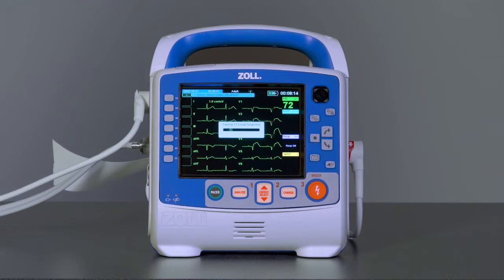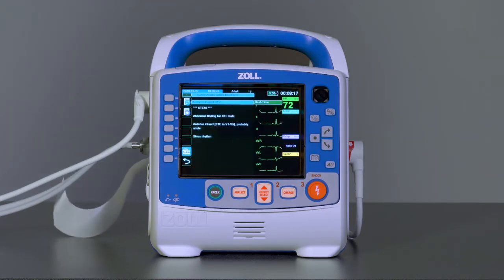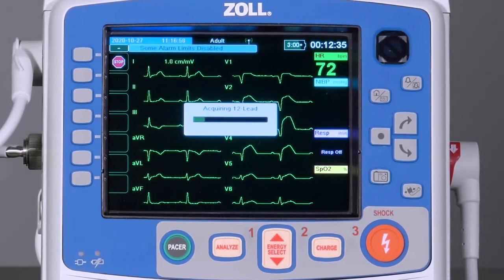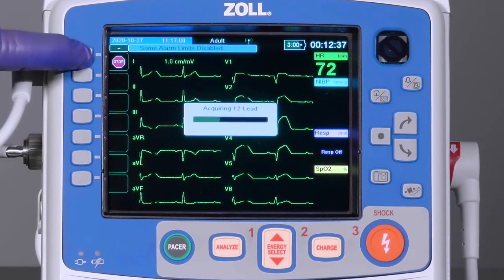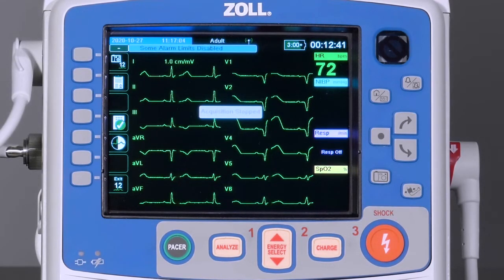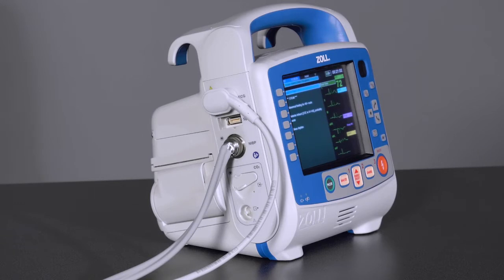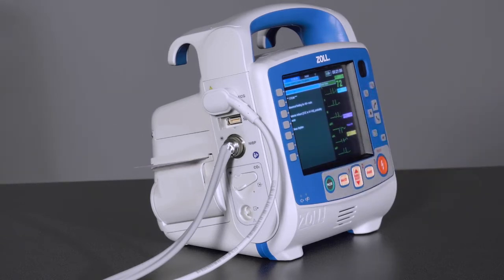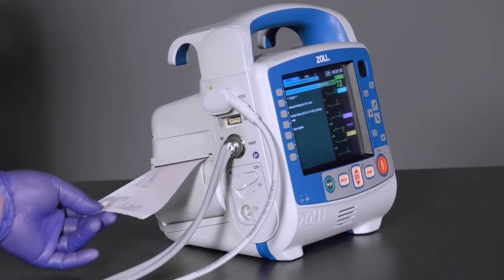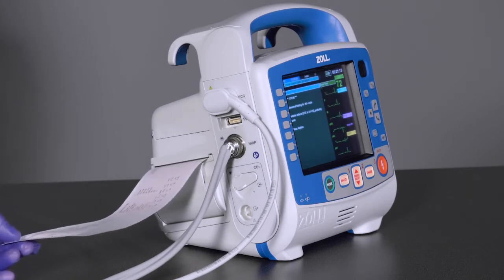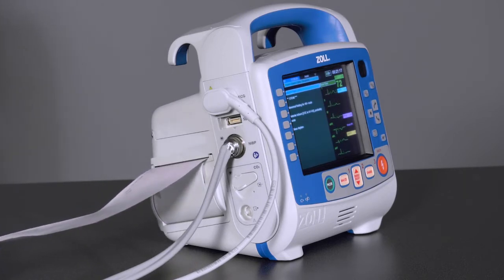It will take 10 seconds to acquire a 12-lead ECG. If needed, a stop key is available during the acquisition, which will cancel the acquisition. Once the acquisition is complete, the X-Series Advanced will save the 12-lead, provide the Innovize Algorithms interpretive statement, display the interpretive statement on the screen, and, if configured to do so, begin to print a copy of the 12-lead ECG.